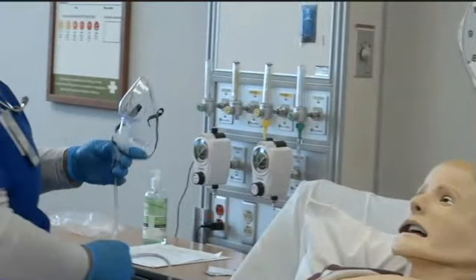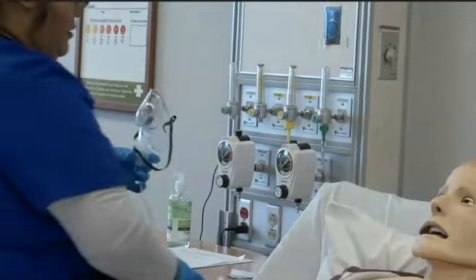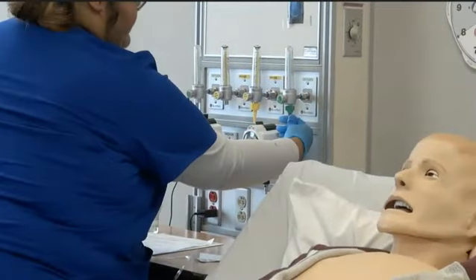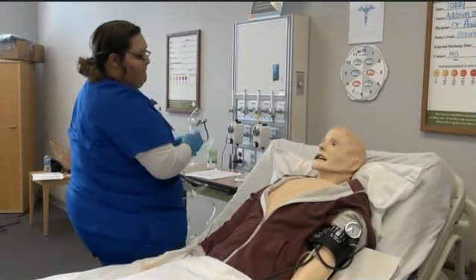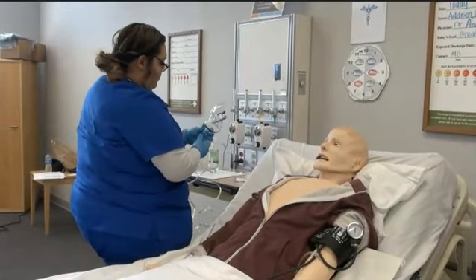If you also notice, the patient coughed and she encouraged the patient to cough. Should the patient not cough, encourage the patient to cough. Coughing is important and it should be encouraged. Notice how the therapist continues to communicate with the patient. How are you feeling? Asking the patient how they're feeling is important.